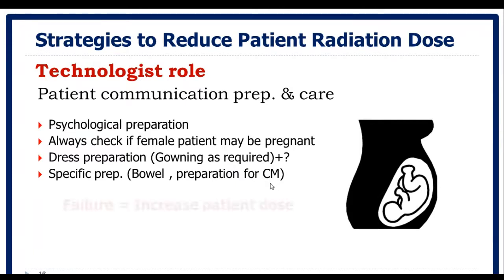All this, any failure will be translated into increased patient dose, because this will affect the outcome of the final exam, and we need to make sure that we are applying all these aspects consistently without any possibility of patient anxiety or whatever, which will affect the final image.